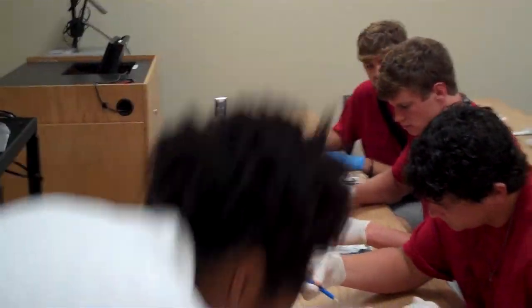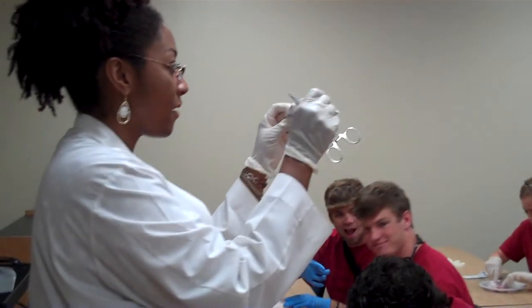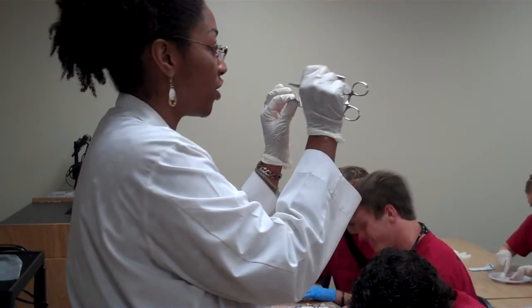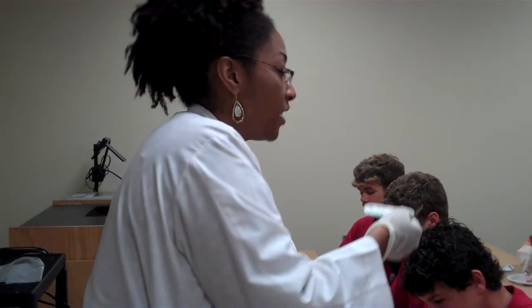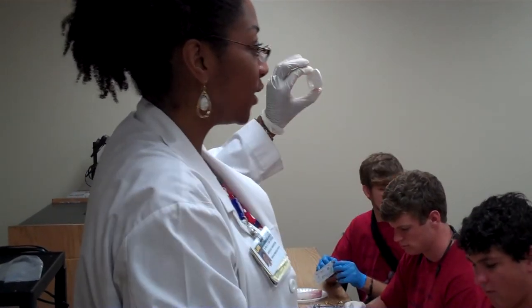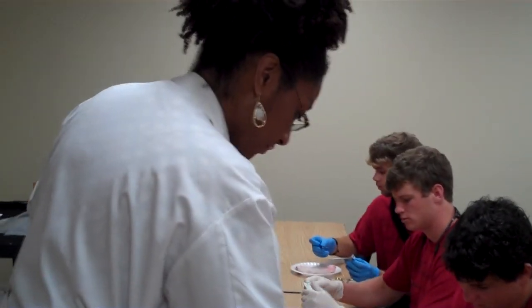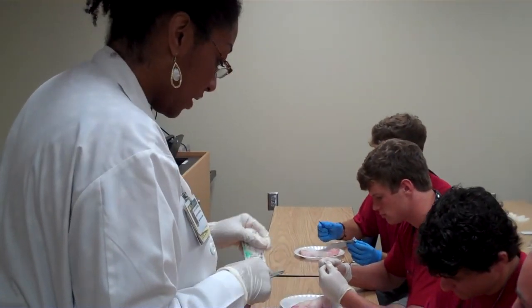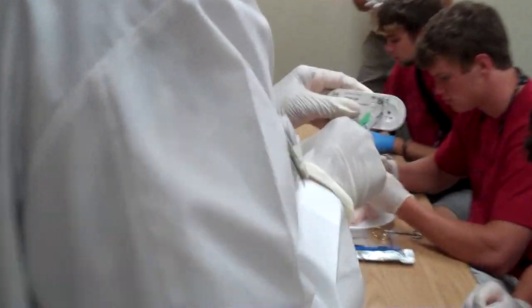You are going to peel open your package. This is your suture, or your stitches — peel that open. You can even pull out this wonderful little card, and you can see how the needle is stuck in there with the needle coming out.